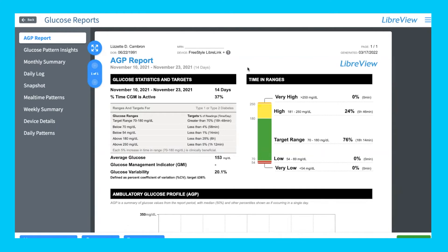In this PDF, you'll see your average glucose report. It shows similar information for the past 14 days: the amount of time your continuous glucose monitor was active, your parameters, and your average glucose. It also shows your time in range — the percent you were in target range, above, or below — to help determine if any changes are needed to your medication or lifestyle.